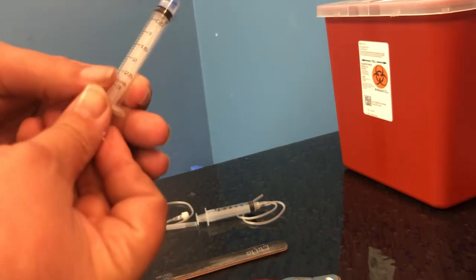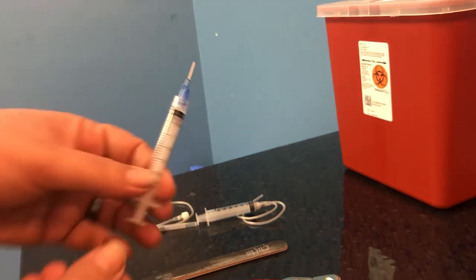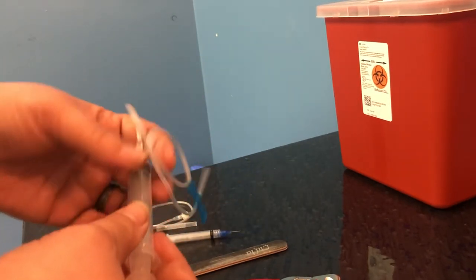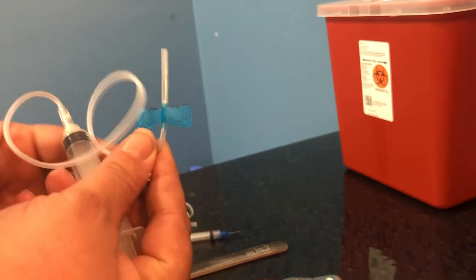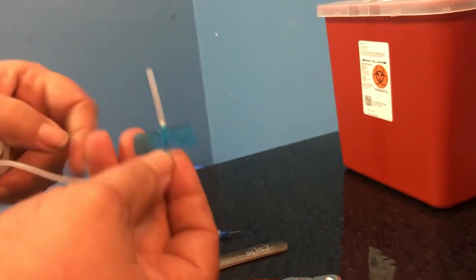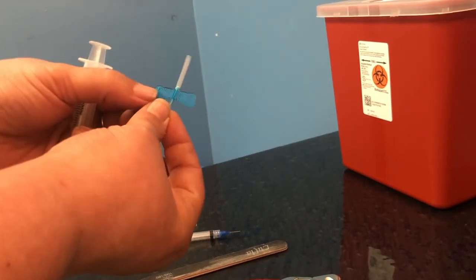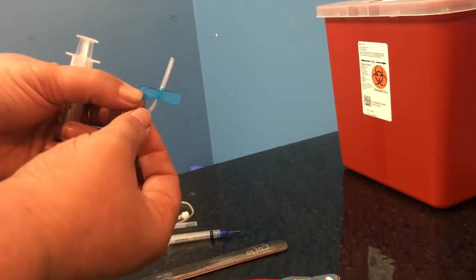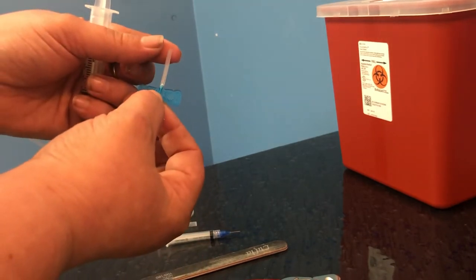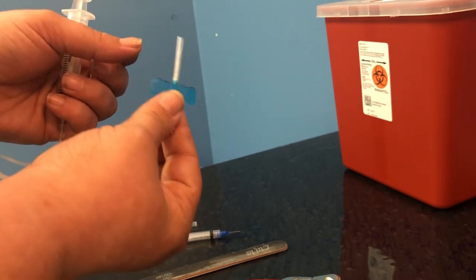All of that is lovely, but sometimes when we're taking particularly a blood sample, it's really helpful to use what's called a butterfly needle. And this is a butterfly. The way that these work is that once I insert this into the pet, if they move slightly, because this tubing is flexible, I can usually follow that movement and I can persevere and salvage my blood collection, even if the animal moves slightly.